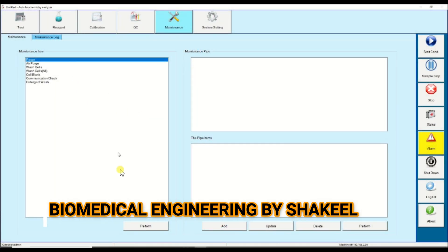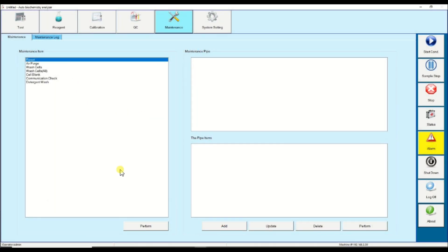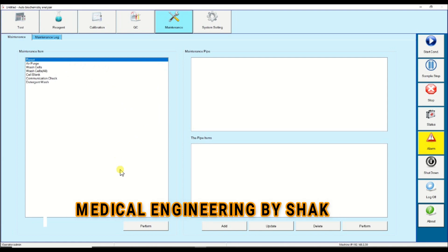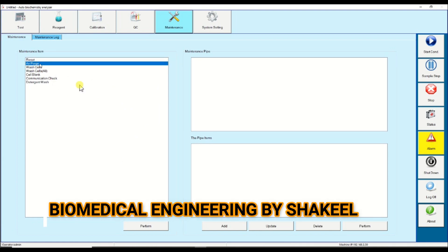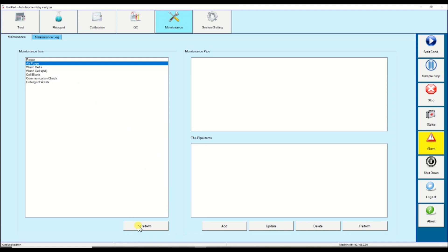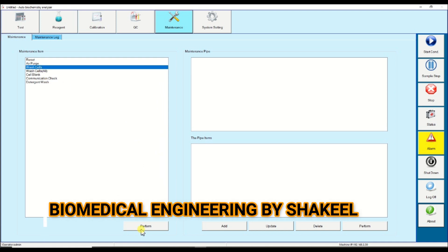Once we start the software, the first step is to do the reset and click on perform. The second step is air purge — air purge means to circulate the water, or in simple terms it is the priming of the machine. The next step is wash cells, so let me click on wash cell.